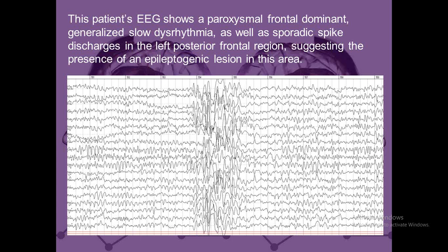And then he was a patient of ours, and finally our doc asked me, he said, Ron, we're missing something. See what you can see on his EEG. So this came up, and it happened one time in 10 minutes. I think this was eyes open. And when that exploded, it's like, oh my gosh, what is that? My reporter said we should have it looked at, so we sent him down for an MRI.